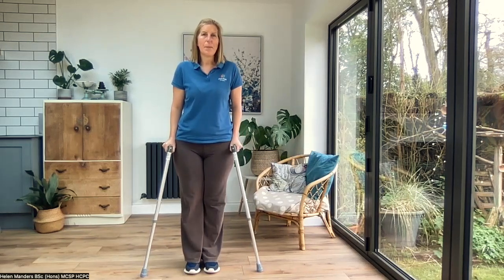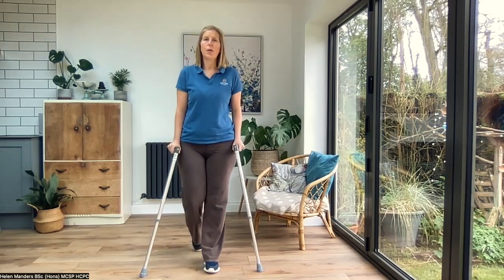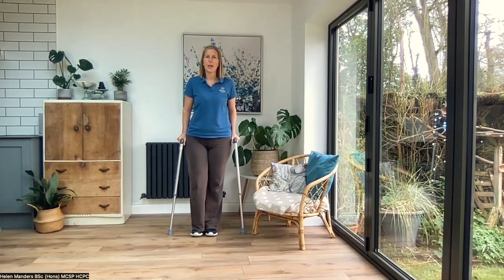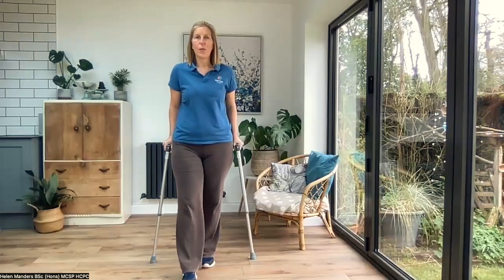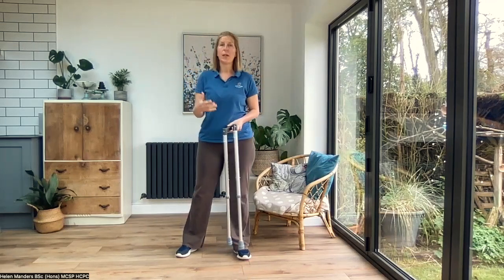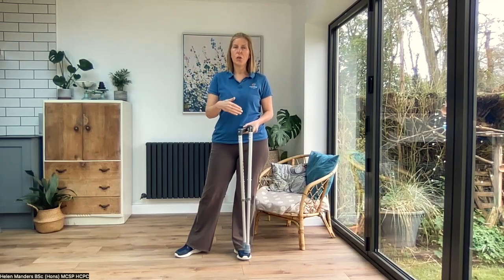As we get a little bit better and we want to progress our walking, a lot of people naturally move towards this walking pattern. So you're moving your sticks forwards, you're stepping with your bad leg, and then rather than meeting it with the good leg, you're stepping through. So sticks, bad leg, step through with your good leg. What you get from that is a more normal walking pattern, you can increase the pace of your walking, and it puts a little bit more weight through the bad leg, but normally that's what you're wanting to do at that stage.